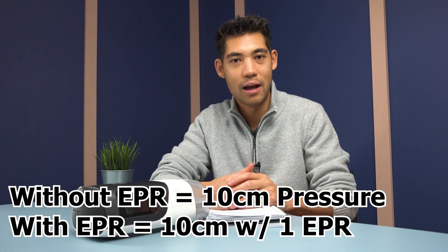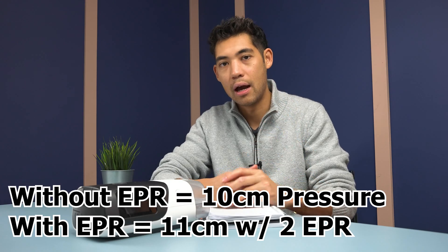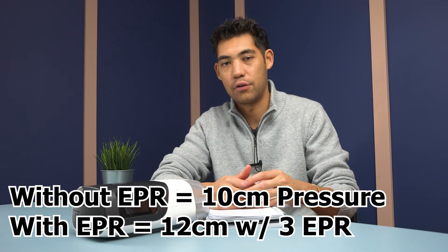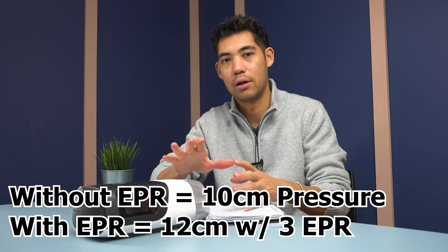For example, say you're starting with a pressure of 10 and you want to turn your EPR on. If you turn it on to one, leave your pressure at 10. If you're turning it on to level two, increase your overall pressure to 11. And if you're turning it on to level three, increase your pressure to 12.